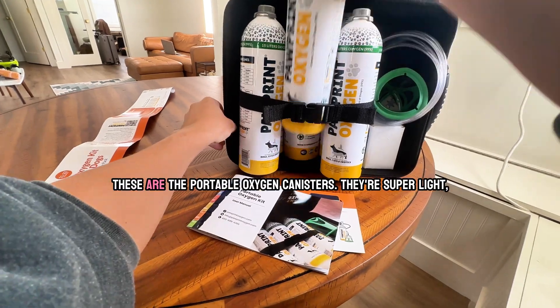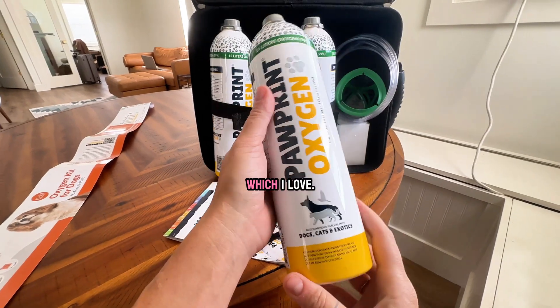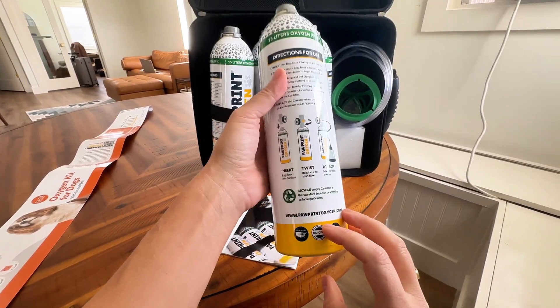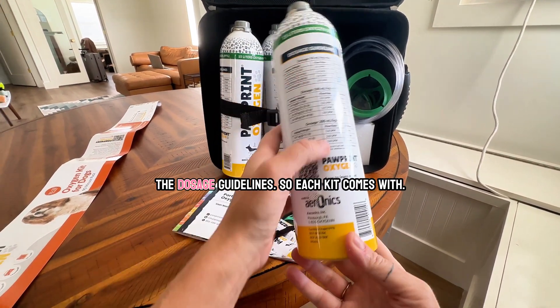These are the portable oxygen canisters. They're super light, which I love. It shows you how to put on the regulator and the dosage guidelines.